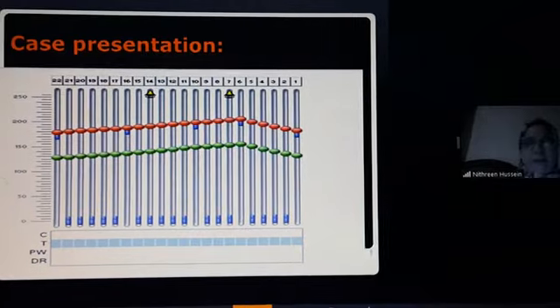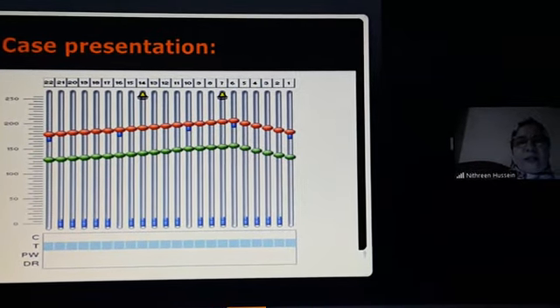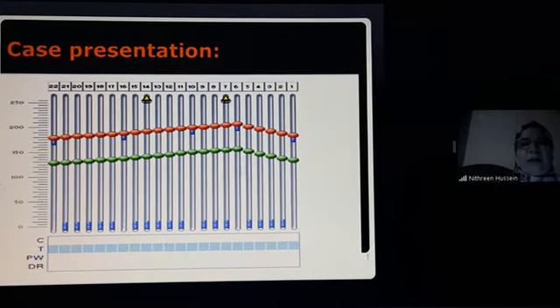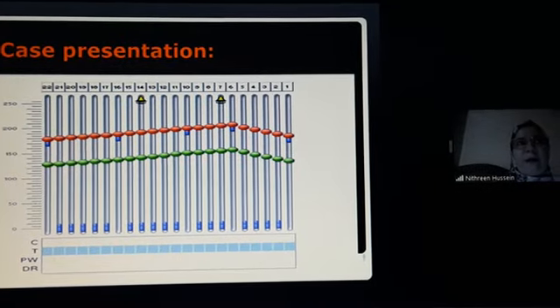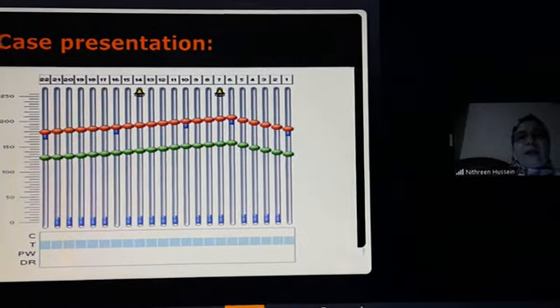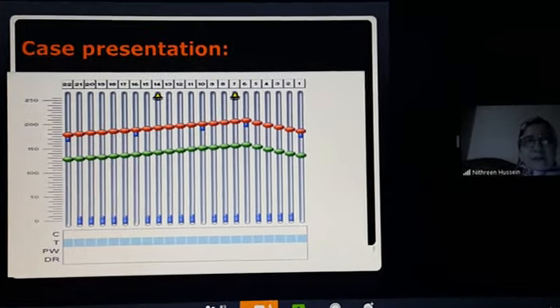But it's very important to know that if you depend totally on the objective tools and don't use any behavioral measures, this will not get the best benefit or the best map for the patient. You have to apply some behavioral measures or subjective measures and get a clear response from the patient in addition to the objective measures.